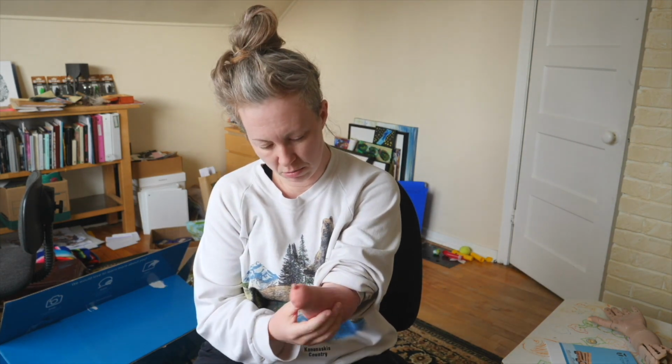So it's sitting on the table, and I guess this is where it just kind of uploads stuff to the Unlimited Tomorrow site, and then they can calibrate it. Or was that the calibration? I don't even know! So I think my next step is trying some of the grips once the calibration is done. Yeah, that was the calibration, because now it'll know how hard to move and stuff like that when I do the muscle movements. Yeah, then I can try moving it.